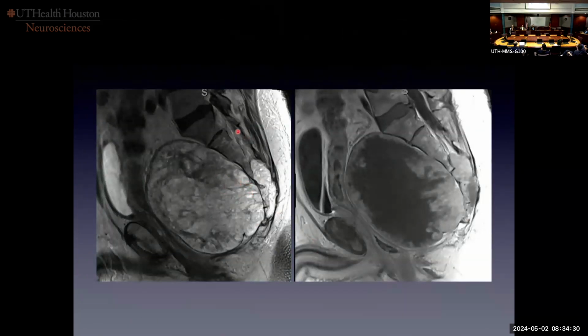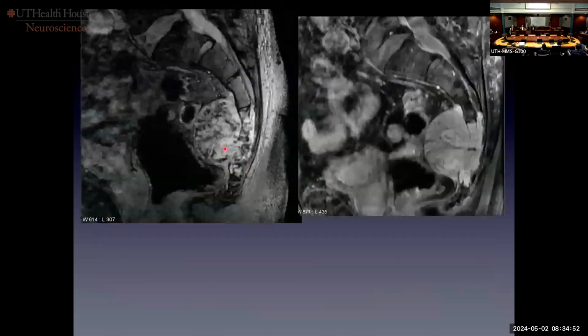And you imagine the fact that the most common location for chordomas to arise is not up in S1, not in the sacral ala, but rather in the lower sacral segments. And oftentimes our MRIs will stop around S2. So just keep that in mind, that you're often not visualizing the most common location at which a chordoma would arise. And it is the most common primary, right?